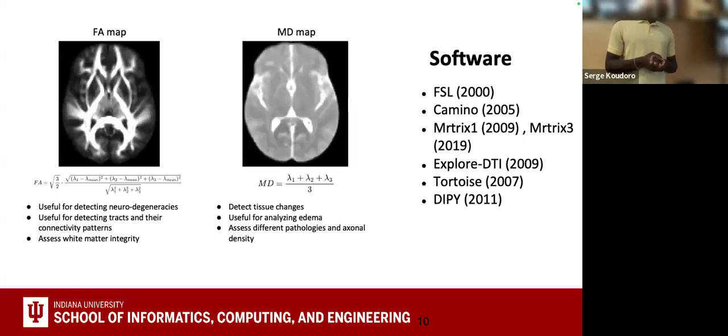So you can see that DiPy is the late one. He's the last one arriving in this field. And why did he arrive? All these previous tools are very excellent. I don't have any issue with them, they are very good tools, and I will always recommend them.